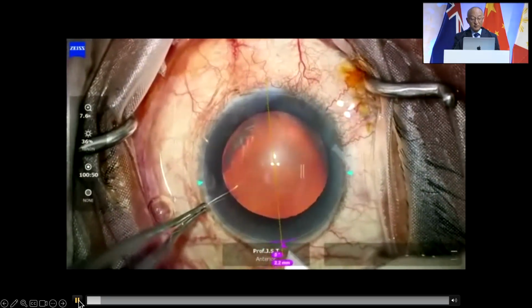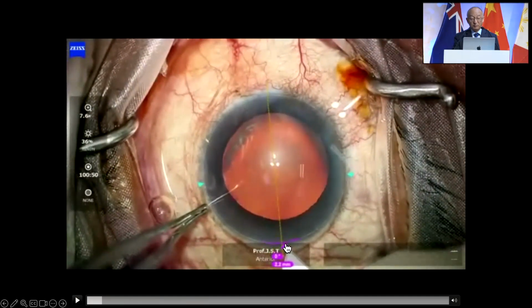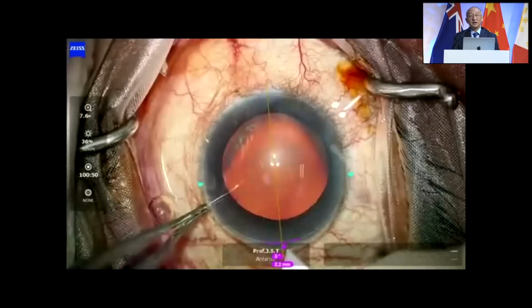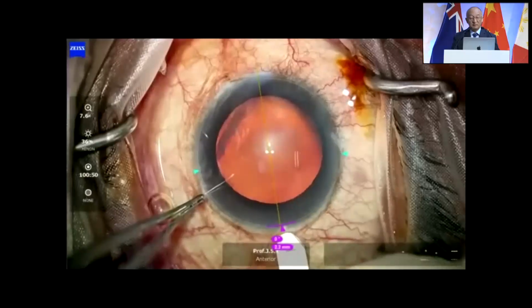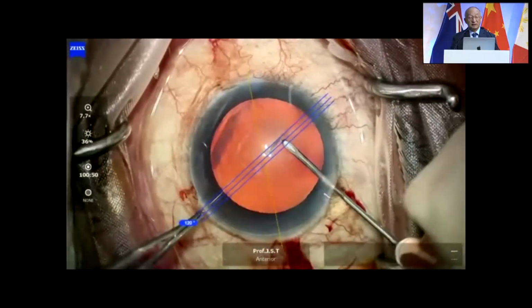These are very, very important tips. So this is the incision mark. This is important because every time you are doing a toric IOL surgery, if you use the same size incision, your SIA is going to be universally the same, so you're not going to modify it. Whenever you're doing toric IOL implantation, don't shift your incision as per the steeper axis. We are managing the toricity by the intraocular lens, not by incision modification. So always remain with the main incision every time, so that you have a nicely calculated SIA, which is quite small if you are using 2.2.